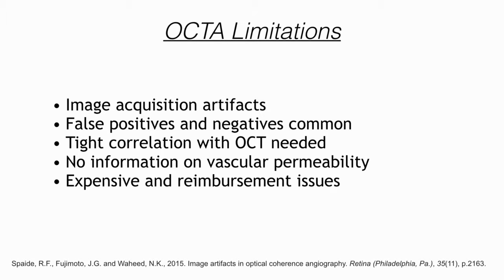There are a host of limitations. There are image acquisition artifacts. There are false positives and false negatives, which are frequent. You need tight correlation between the OCTA and the OCT. And it doesn't give you any information on vascular permeability. It's expensive, and oh, did I mention if you do an OCT the same day, you're not going to get paid.